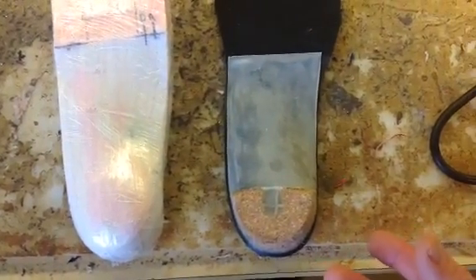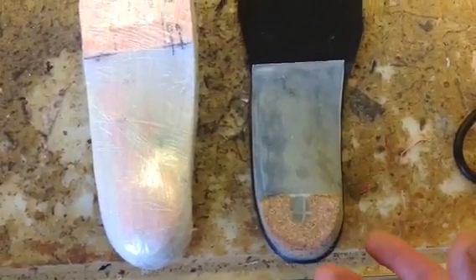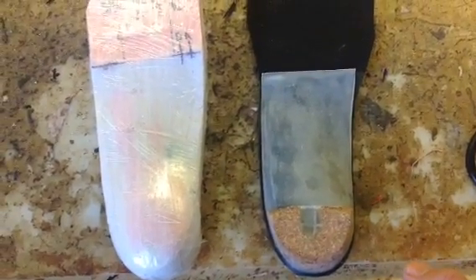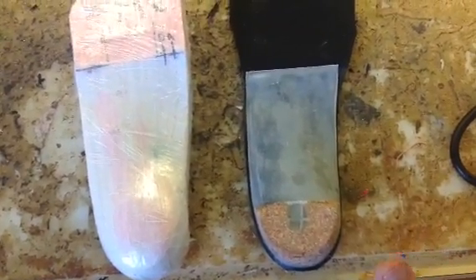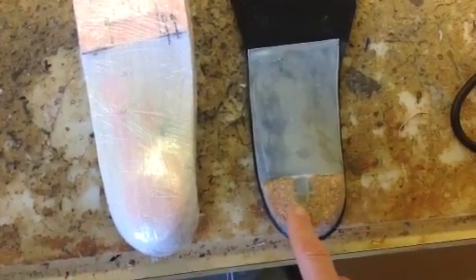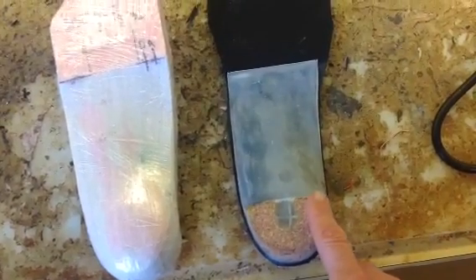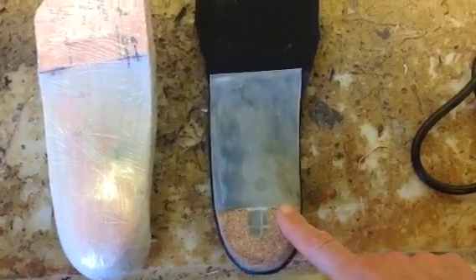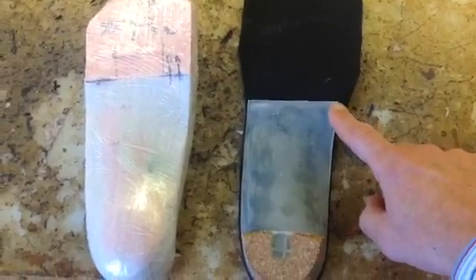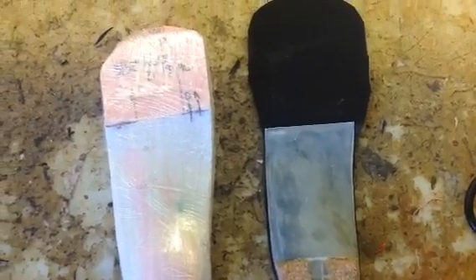If the patient complains of shock absorption problems or jarring problems, you can easily grind motion in the post. You grind it from the lateral one half here, because you always want the medial or the arch side of the post to line up with the front edge of the plastic at the end of the orthotic.